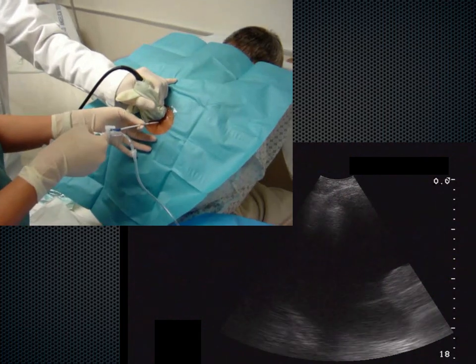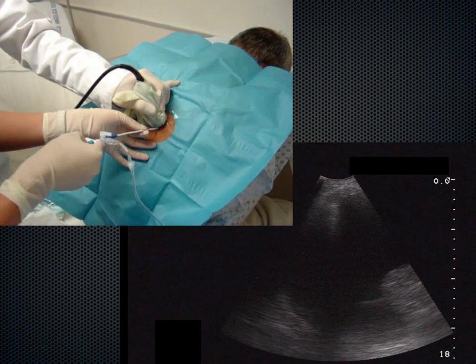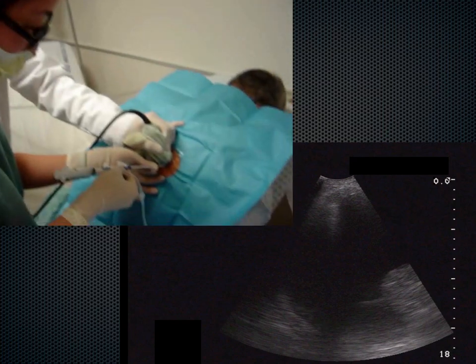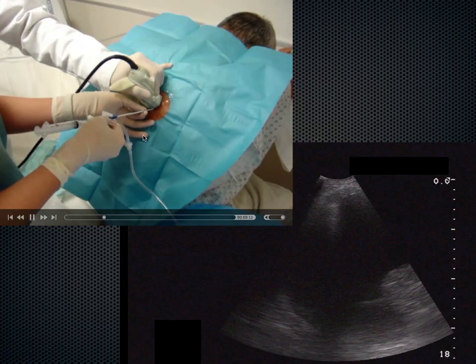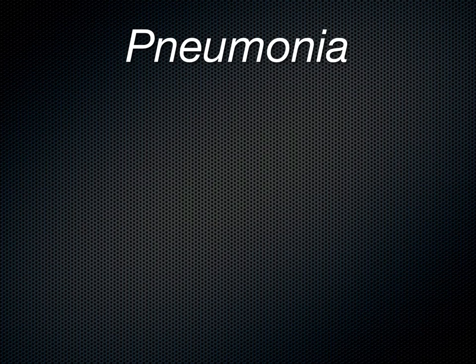Okay. See my needle. So sometimes it takes two operators depending on your kit. Just incorporate someone else in your field. This person should have a mask on. The pic here is an example of how you basically watch in real time what's going on.